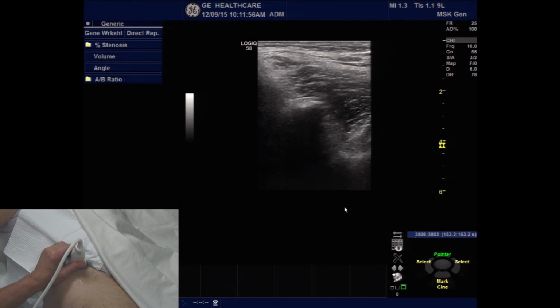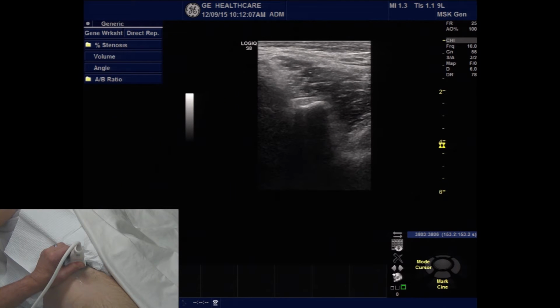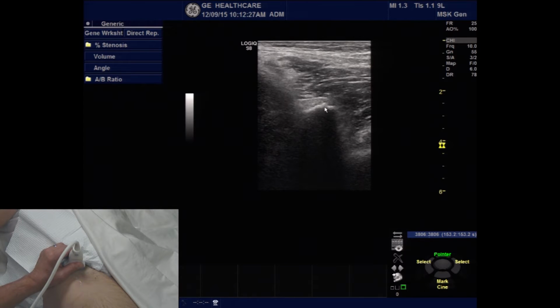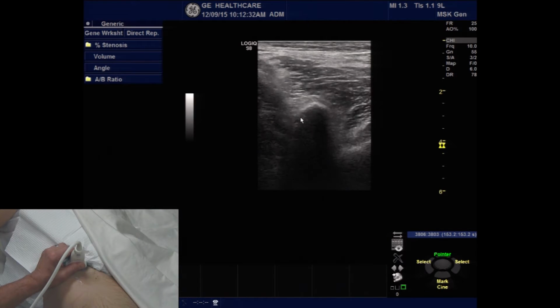One of the techniques for location of the femoral head, especially in a difficult to scan patient, is to actually use the bone anatomy to guide you down to the hip. When we start scanning, one of the preferred techniques is we can start at the anterior inferior iliac spine, and sitting just superficial and attaching to the anterior inferior iliac spine is the direct head of the rectus femoris tendon.